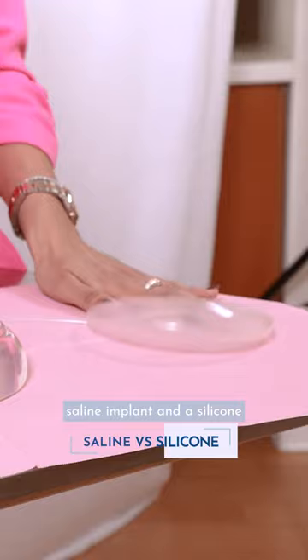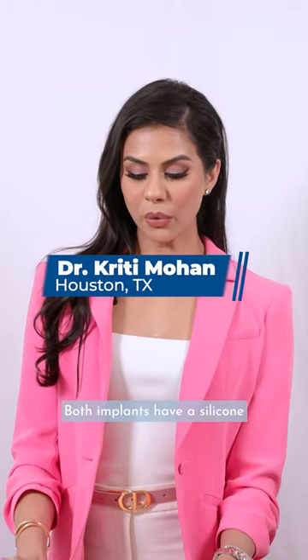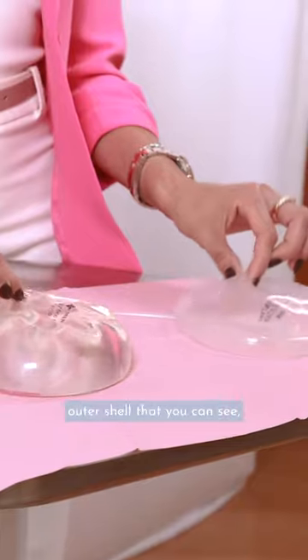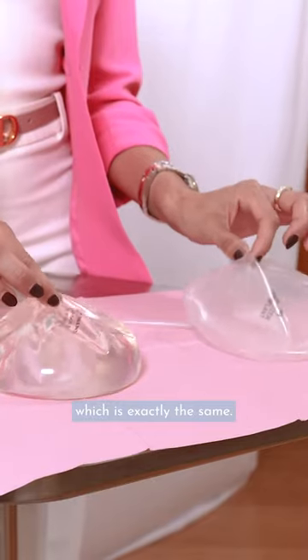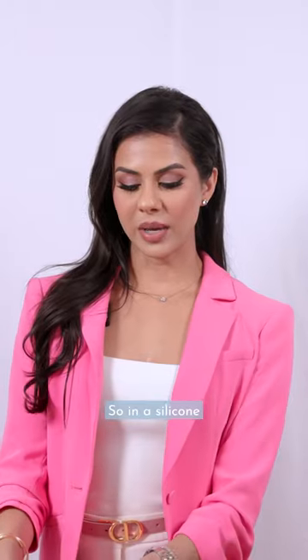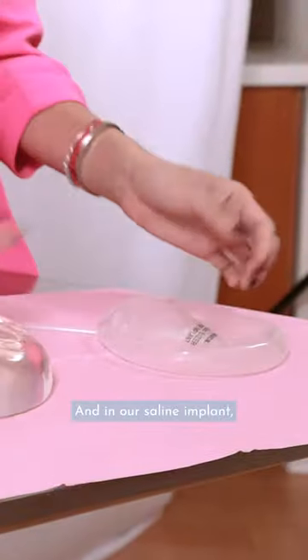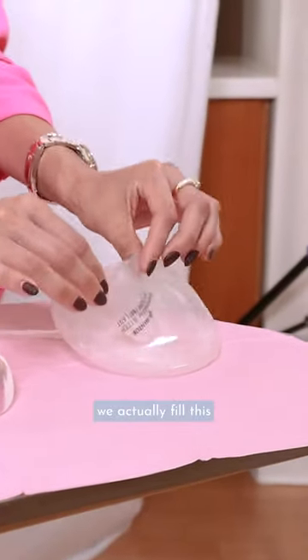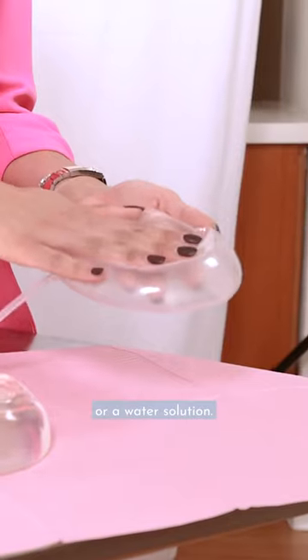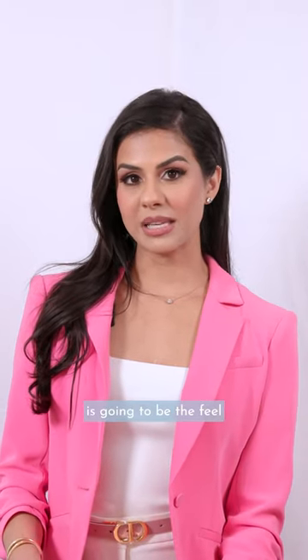Here we have a saline implant and a silicone implant with some key differences. Both implants have a silicone outer shell, which is exactly the same. The difference is in what the stuffing is. In a silicone implant, that's going to be our silicone gel material. And in our saline implant, we actually fill this with saline, or a water solution.